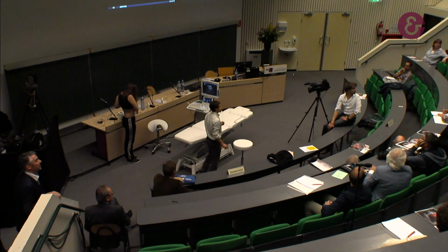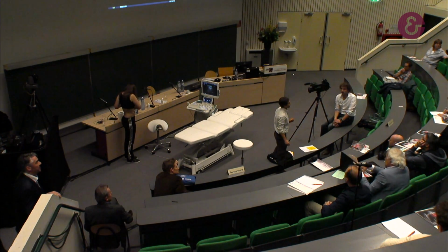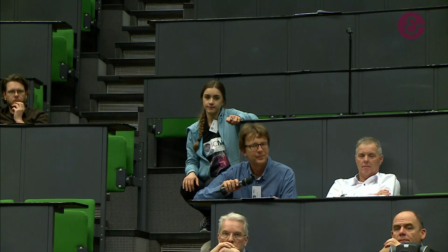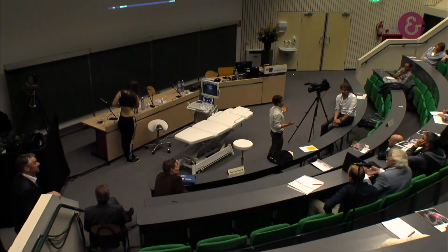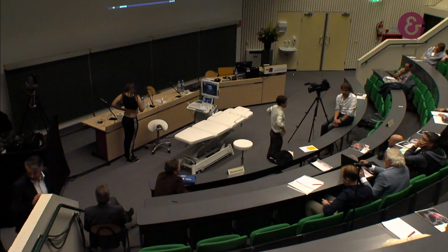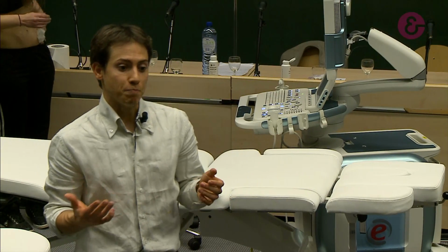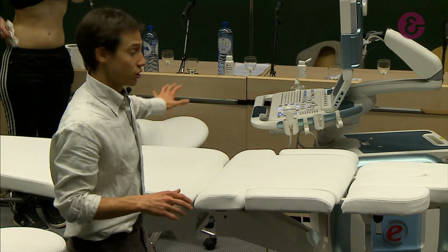What do you do when a patient is not able to contract transversus? So normally, after my clinical examination, if there is a poor motor control of this muscle, I start lying down as today.